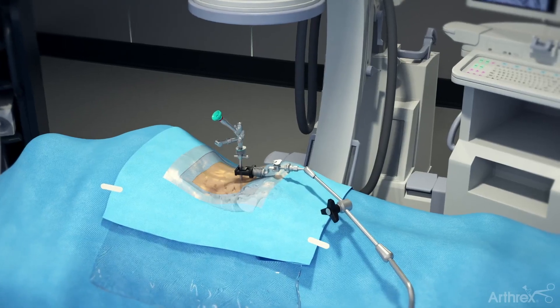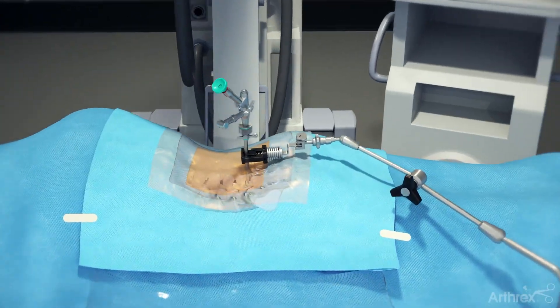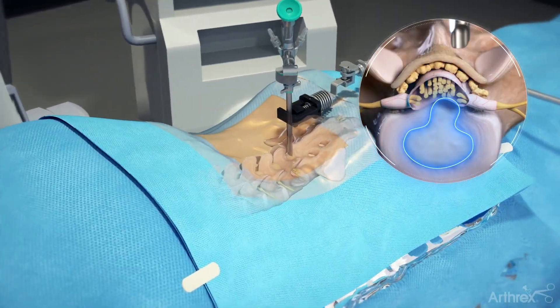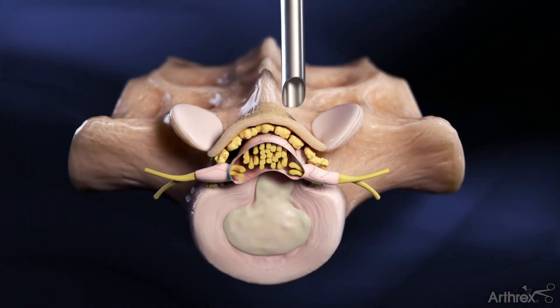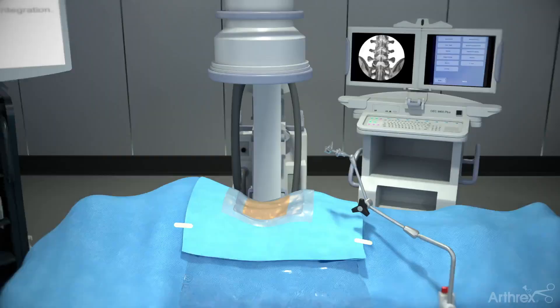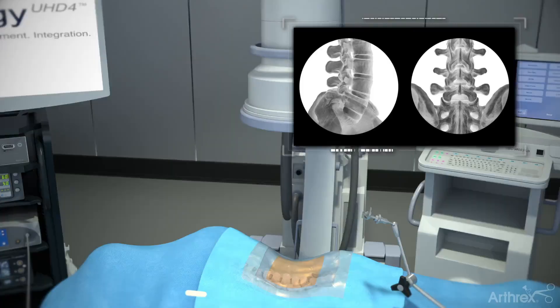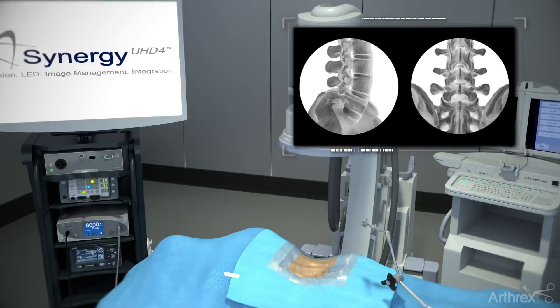Arthric's interlaminar endoscopic approach for a discectomy is an ultra-minimally invasive surgery, ideal for patients diagnosed with a paracentral lumbar disc herniation. In this procedure, the endoscope is used to assist in the approach for access and visualization. Place the patient in the prone position and use a C-arm to verify the correct level being treated, using both AP and lateral images based on the preoperative MRI. Use a six-step approach to complete the procedure.